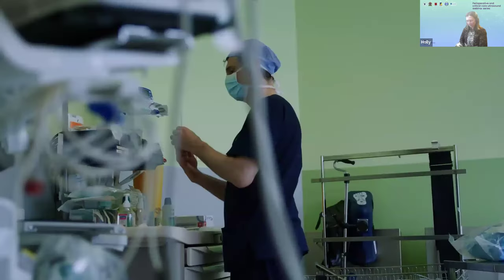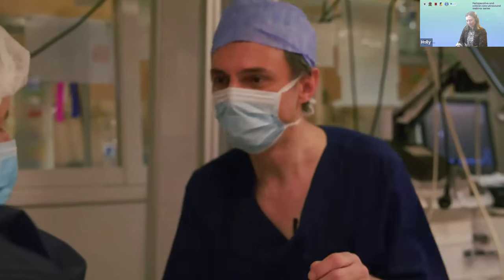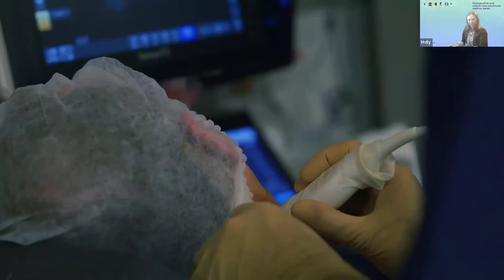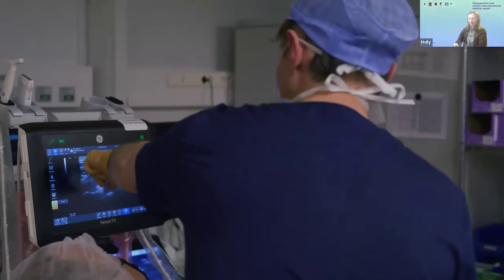How are you, sir? How did you specifically get into the use of point-of-care ultrasound? I've been practicing anesthesiology as a diplomed anesthesiologist for more than 15 years. We do a lot of peripheral regional anesthesia. This is not local anesthesia. This allows the anesthesia of a whole area of the body, like for example a hand, a forearm, a wrist, a foot, an ankle. And we can do that by putting local anesthetic beside the nerve that goes to that specific region. We identify the nerves with ultrasound and we inject local anesthetic.